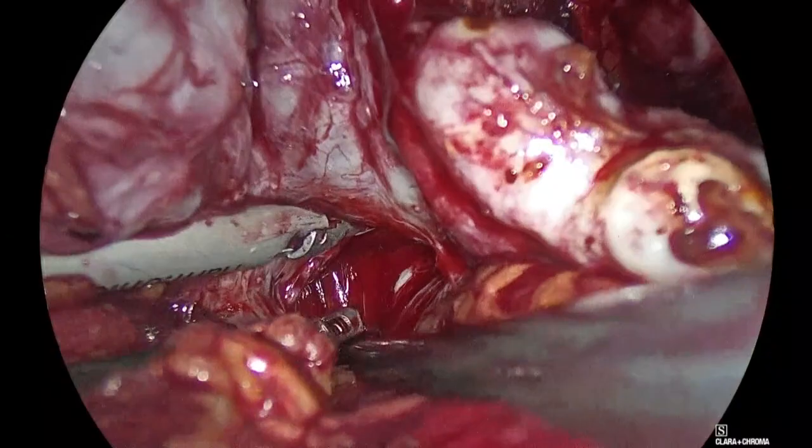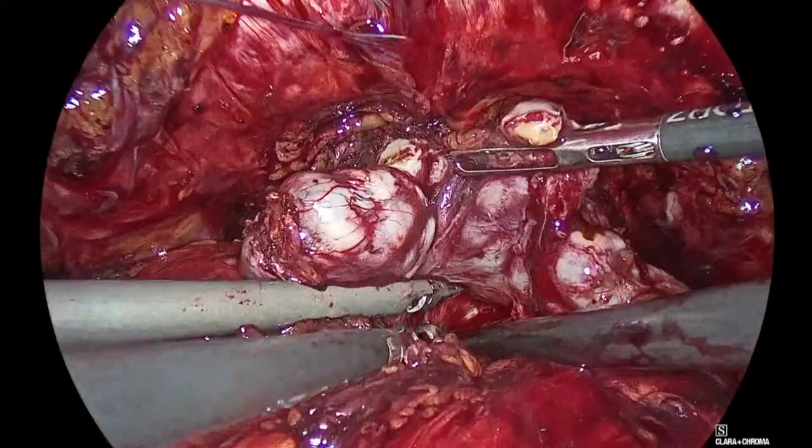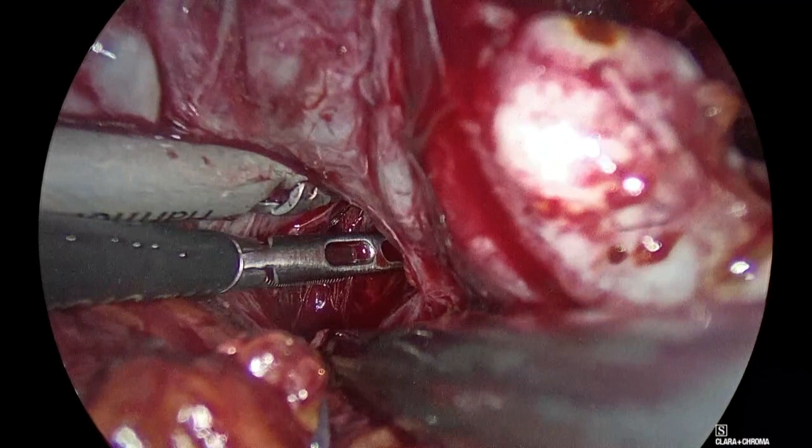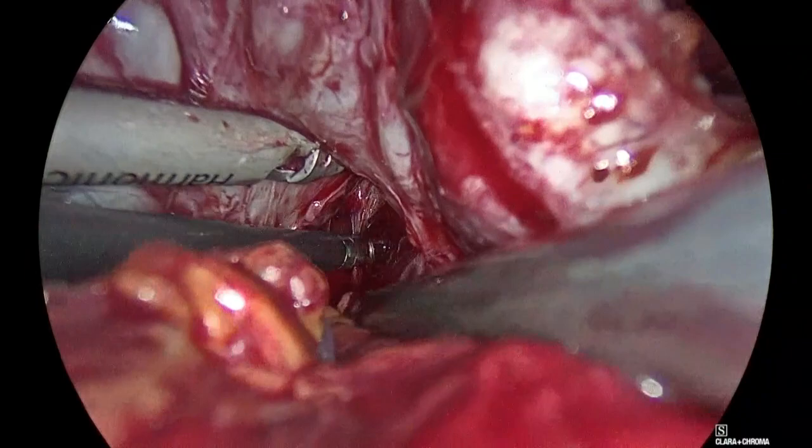Aspirate inside. Padeli, you're not straight. Go back. Panagiotis, pull the prostate out of the pelvis, please. Good. There you go. Come in. Closer. Good. So once you don't see the fat, you're quite safe with your other structures.